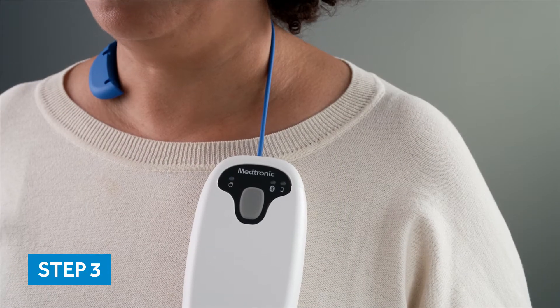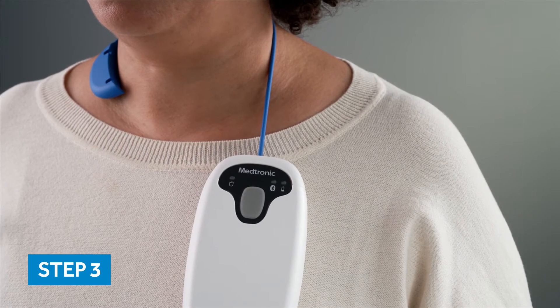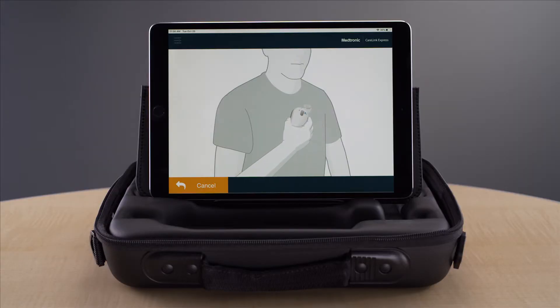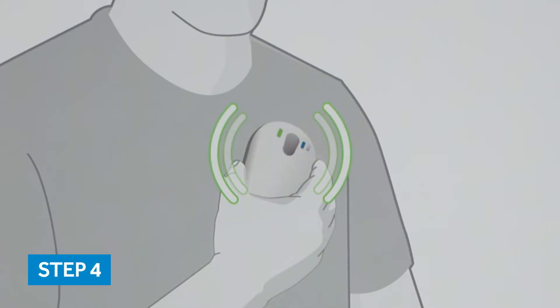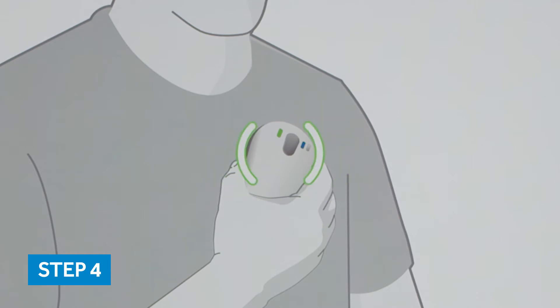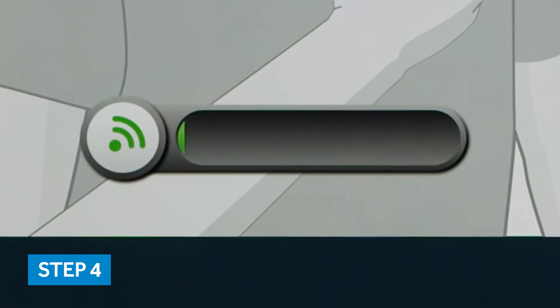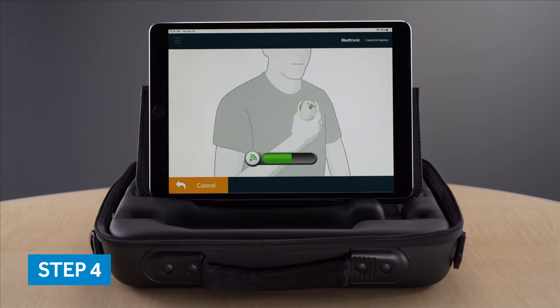The patient connector is placed over the patient's cardiac or ICM device as shown in this animation. A green light will appear on the patient connector indicating a connection has been made with the patient's device. While holding the patient connector over the patient's device, the app will display a green progress bar that lets you know the connector is positioned correctly and receiving data from the patient's device.